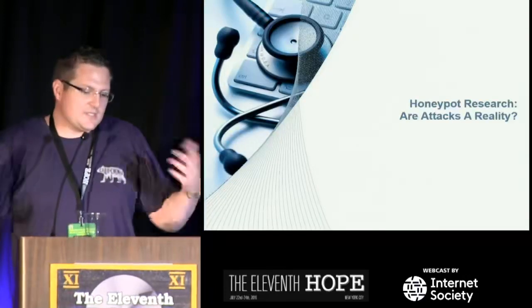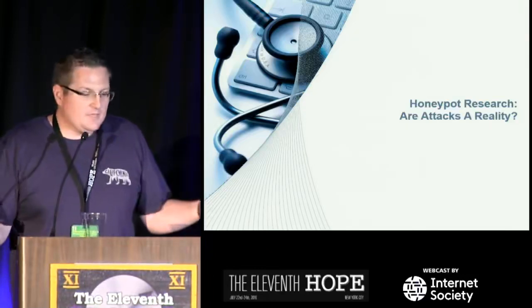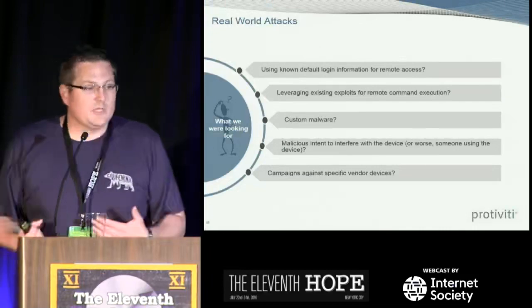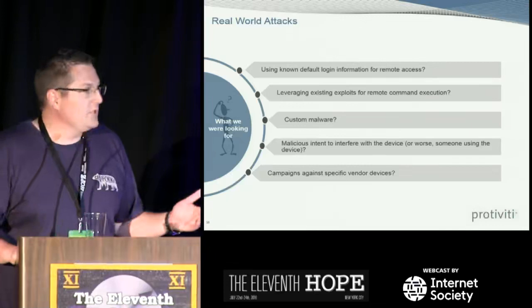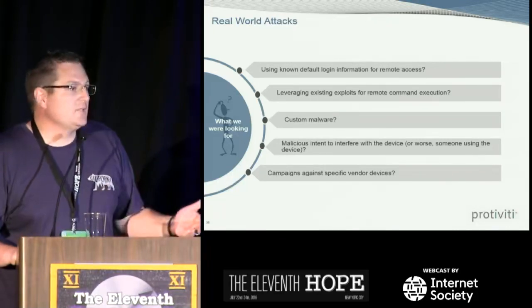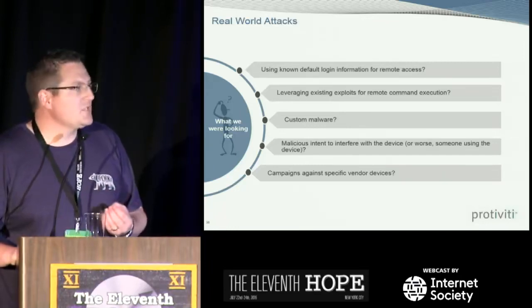So we have vulnerable devices. They're connected to the internet. Not that difficult to get remote access. So I worked with another researcher, Mark Kalau, and he's a massive honeypot guy, and with him we set up some honeypots to see what's happening. So we're basically looking at setting them up realistically. So if they had poor default login credentials like I showed you, we mimic that completely. We wanted to see, are there specific campaigns against specific vendors? Are they attacking medical devices? If they're attacking medical devices, is it targeted? Are they trying to steal intellectual property, source code, things like that? Try to get an understanding of the motivations.